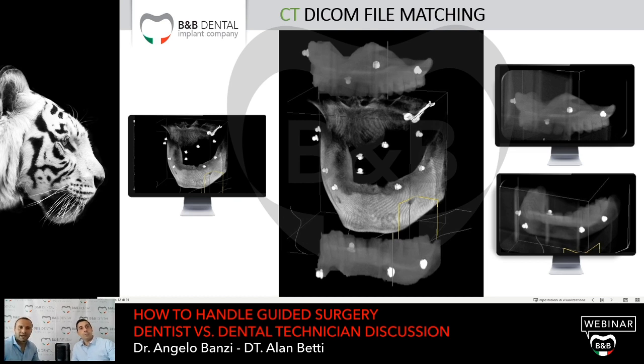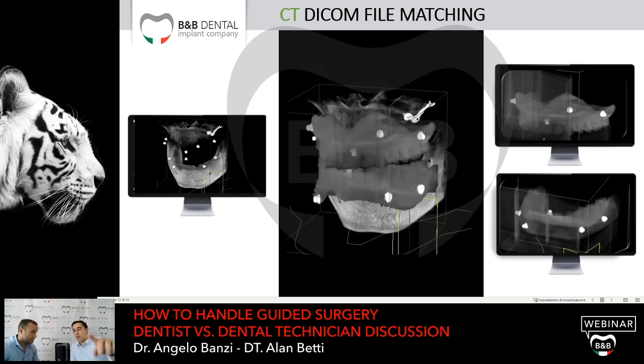The radiological template exam is going to be transformed into an STL file to be matched with the DICOM file of the patient wearing the radiological template. We transform the DICOM files of the radiological template into STL files in order to align these two different files by our radiopaque markers, and we can obtain from the radiological template the mucosal part. This is really important, because the CT machine doesn't allow us to have any soft tissues in the imaging.